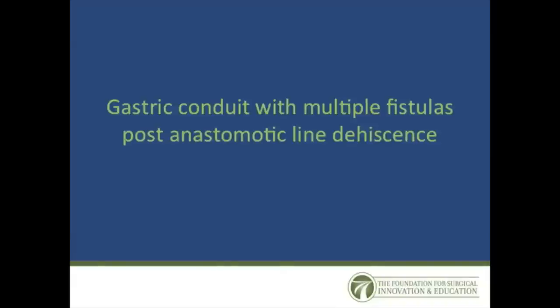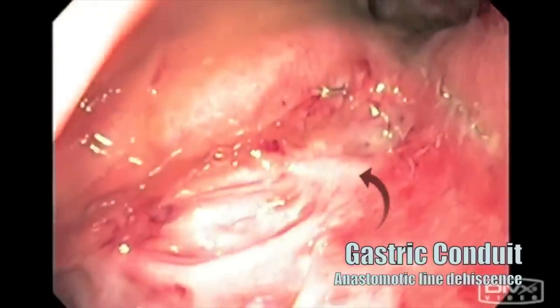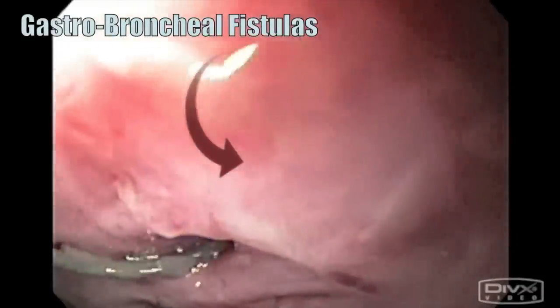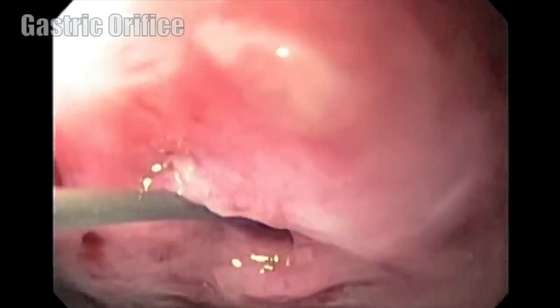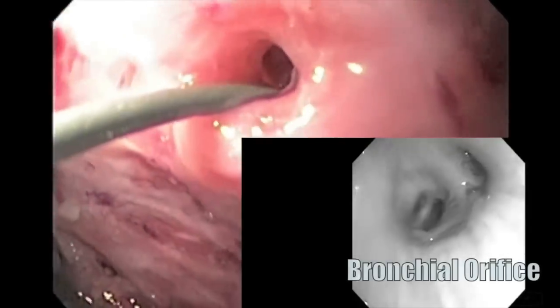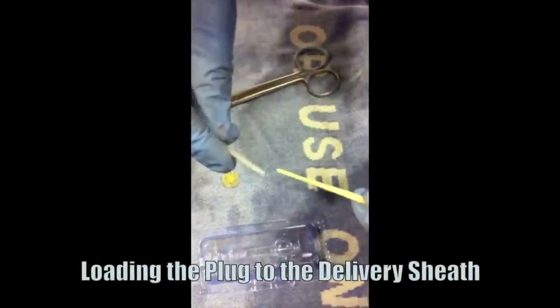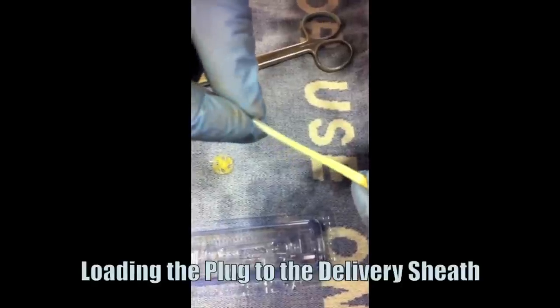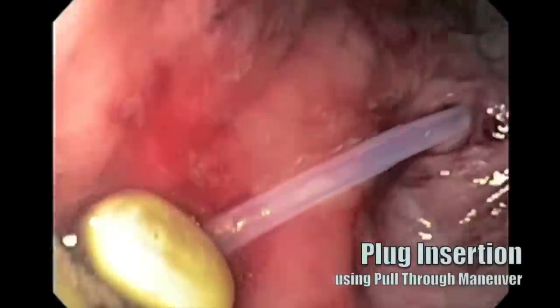Here we present another option in a patient with multiple fistulas within a gastric conduit post-anastomotic line dehiscence. One can see the multiple fistulas within the gastric pouch. There are multiple gastro-bronchial fistulas; as demonstrated, the guide wire passes from the gastric conduit to the bronchial orifice through the gastro-bronchial fistula.